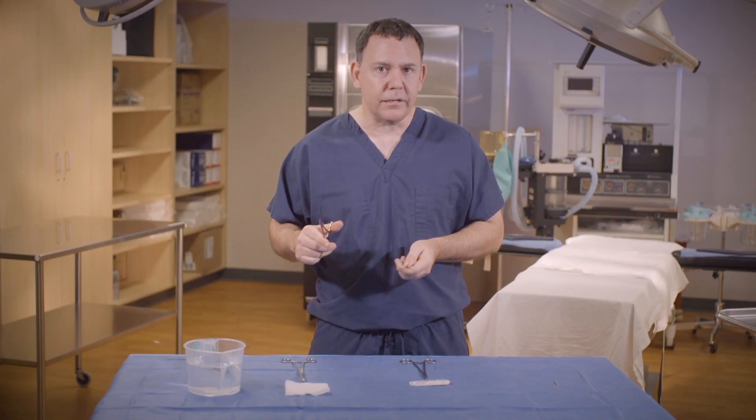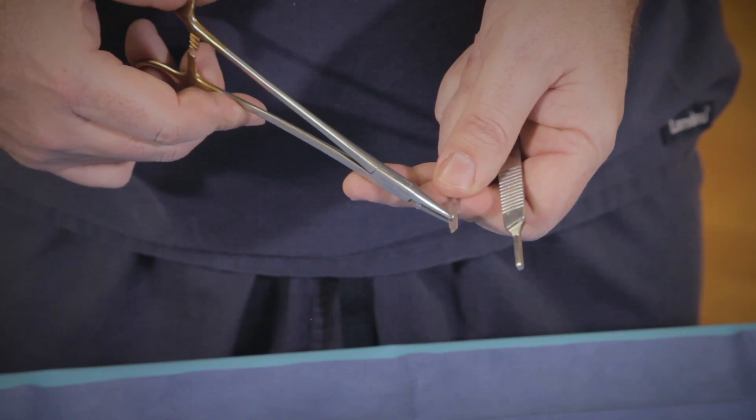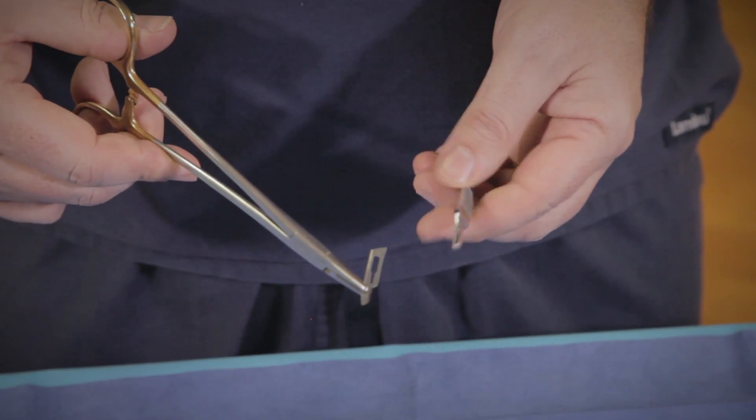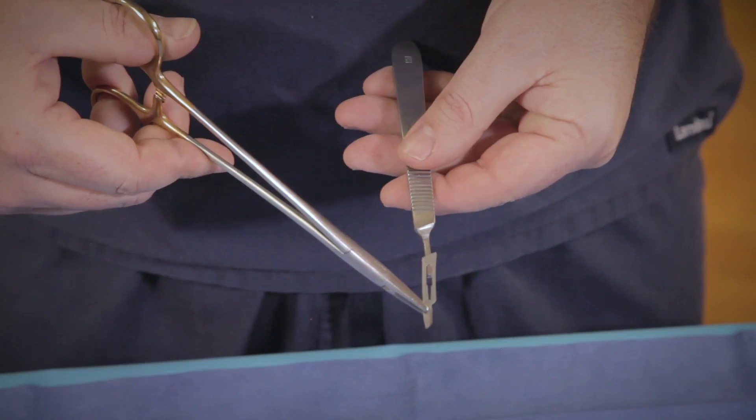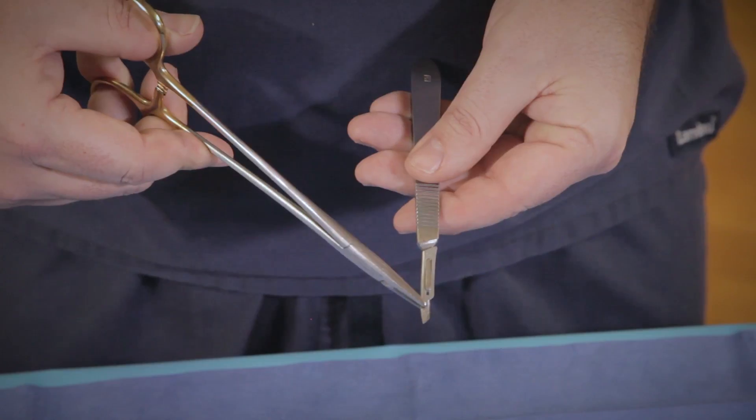So I want to show you that again. I'm going to grasp the blade — the sharp end is facing to the left. Angle matches the angle. I'm going to fit the blade into the ridge and slowly slide it on until I hear the click.